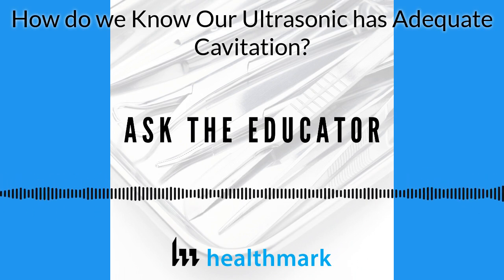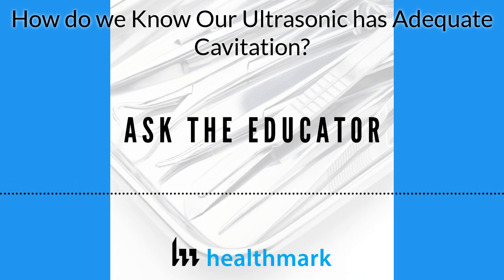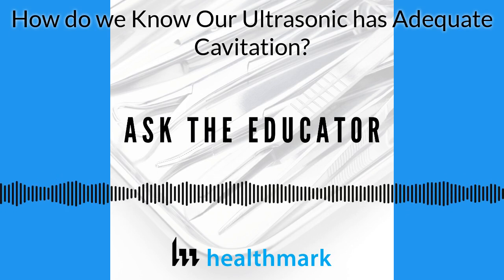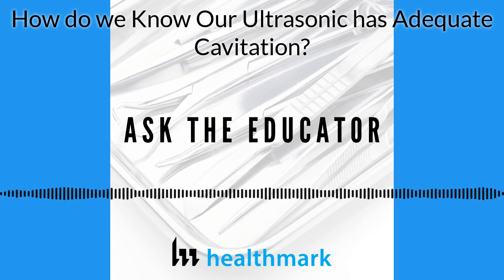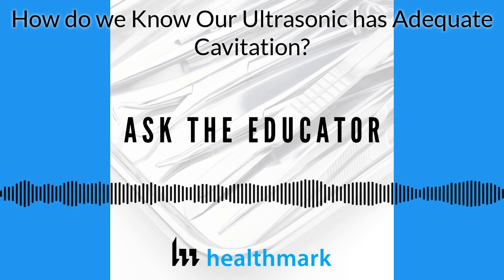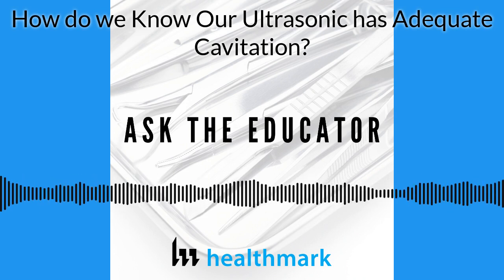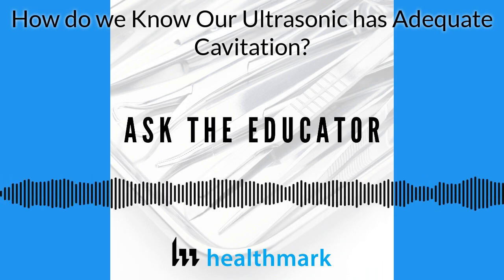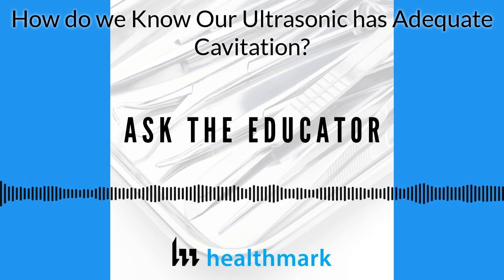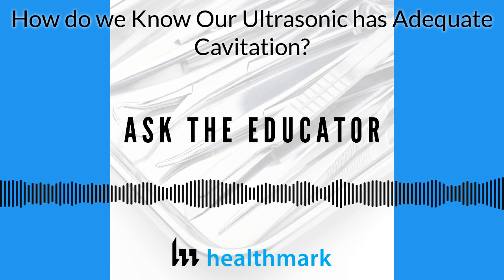Think of, some people just have a small tabletop. It's one level. It could be a small one like a jeweler or dentist use, and some have those size for their eye instruments. Or you have big units with big footprints, but they're just one tank. So within there, you're just putting in one tray or two trays. There's not a lot of other metal being put in.